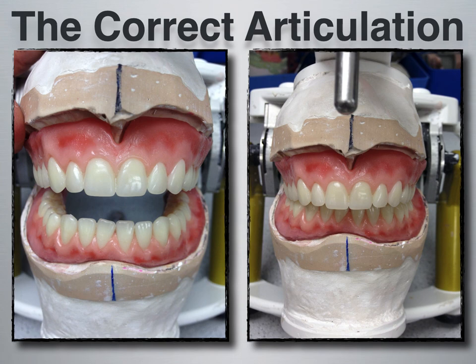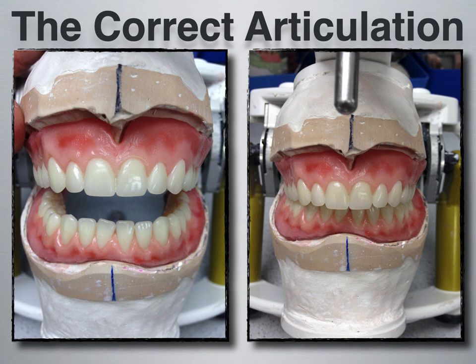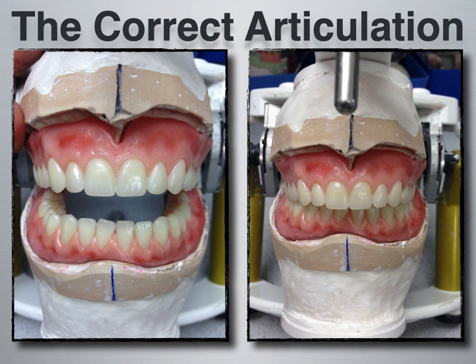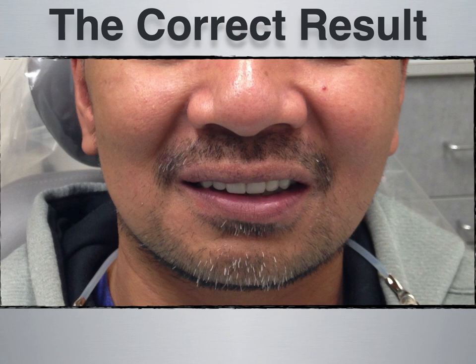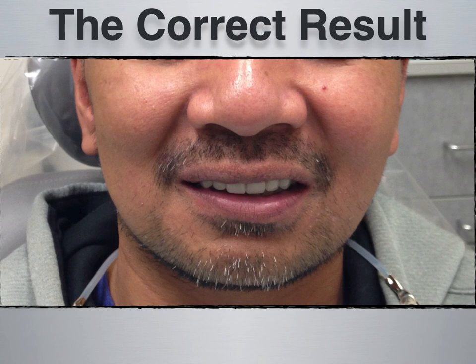Always check that the bite is passive, that the casts sit within each arch snugly, and if using a face bow, make sure you are using that face bow transfer properly. A correct articulation will lead to a correct setup. As seen here, this case was mounted and set — the patient was a class two occlusion, meaning they were retrognathic, with their lower jaw pushed backward. A correct bite should lead to a correct articulation, which then leads to the correct result. In this Dentures 1 course, we will end the semester at the stage of the complete denture wax try-ins.